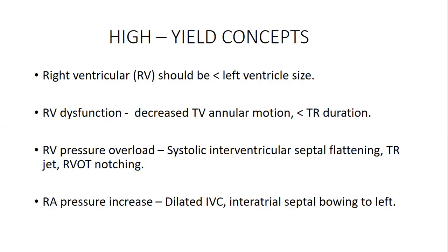And when you see the right atrium pressure increase, what does it mean? I know a lot of us are practicing abdominal ultrasound, and sometimes we find that the IVC is dilated. What does it mean to a cardiac sonographer? What are you supposed to indicate? Or if they bring a patient for abdominal ultrasound and you find that the patient has a dilated IVC, can you recommend that this patient may need a comprehensive cardiac ultrasound? Those are some of the things we need to look at.